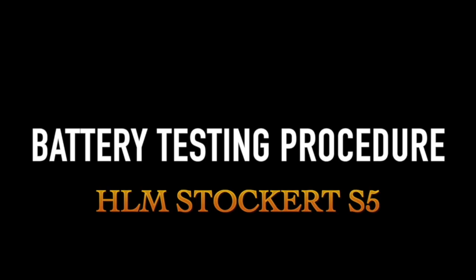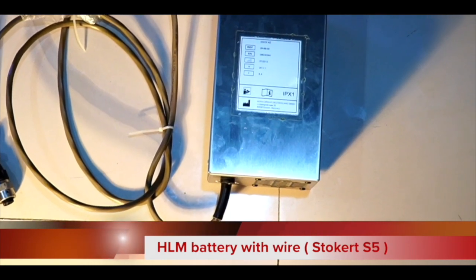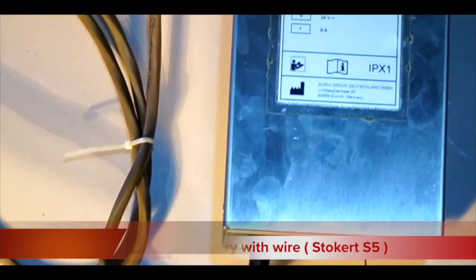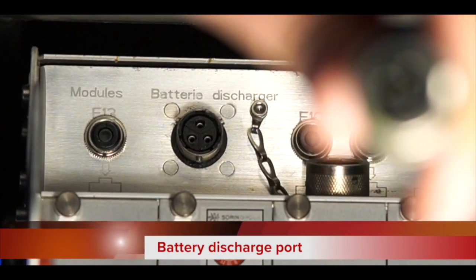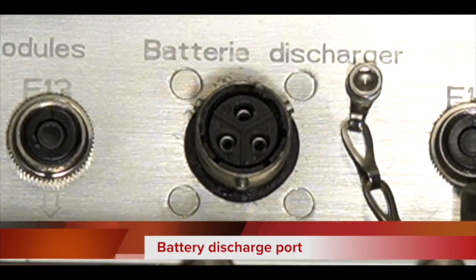This is the battery with wire and it has a three-pin connector which we are going to insert into the battery discharge port. Now you can see I have inserted the battery connected into the battery discharge port of the heart-lung machine and tied with clockwise direction.